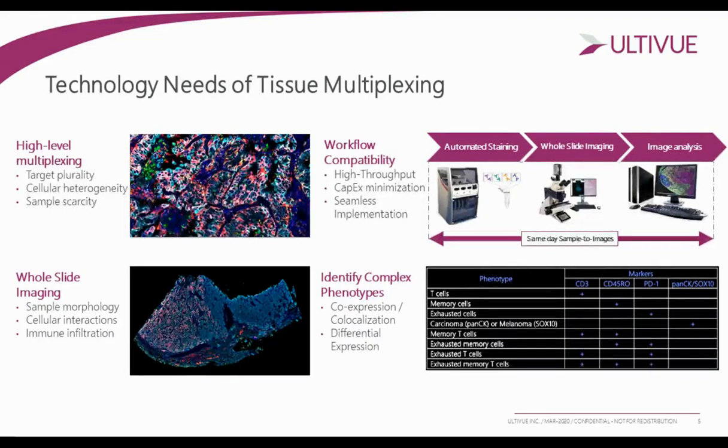We also want to make sure we can have whole slide imaging. We can see clear and very defined cell morphology. We can visualize cell-to-cell interactions and really characterize any types of immune infiltrations and unique characteristics of the tumor microenvironment.